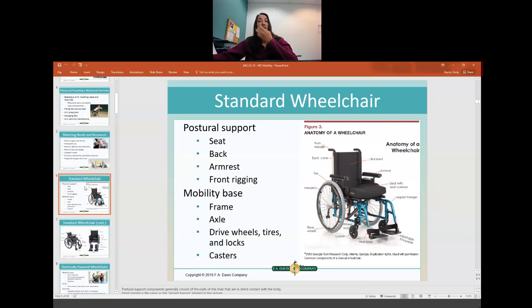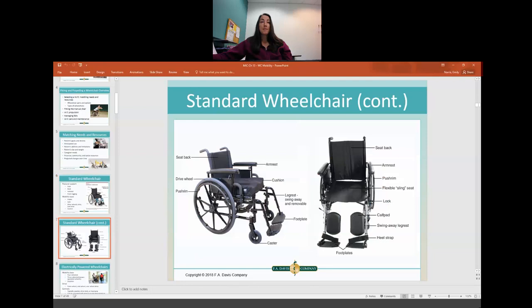Parts of the wheelchair include the backrest, seat, armrest, and front rigging — all of which provide postural support. Mobility comes from the frame, axle, and drive wheels, which are the big wheels. The casters are the small wheels in front. We have locks to put the brakes on, and the leg rests and armrests can typically be removed and replaced. A calf pad can be added for someone with significant weakness to keep their leg from falling off the back.